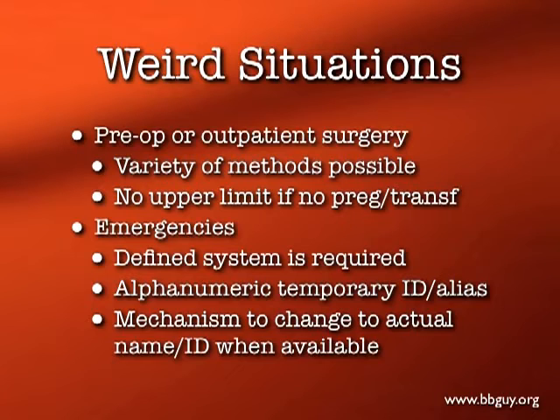Doesn't necessarily work all that well, but there are a lot of creative methods that we can do. Again, you can only do that if the patient has not been pregnant or transfused. If they have been, they're going to need a new sample on the day of surgery, unless it's been less than 3 days.